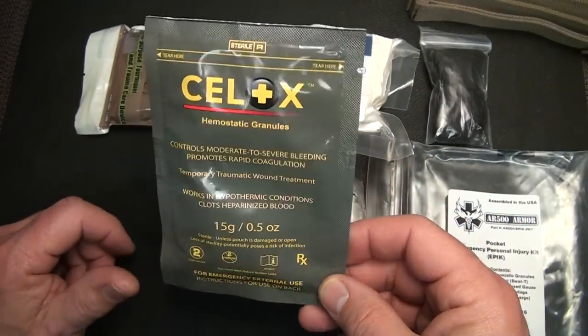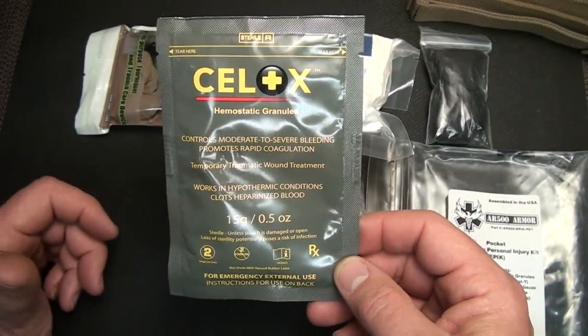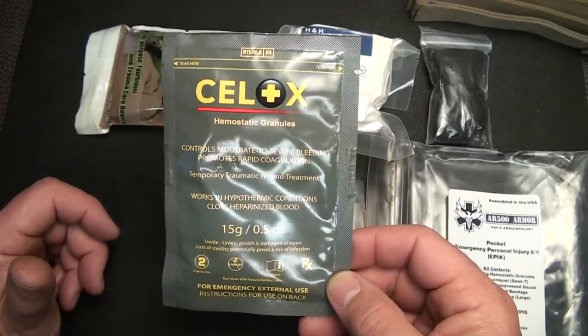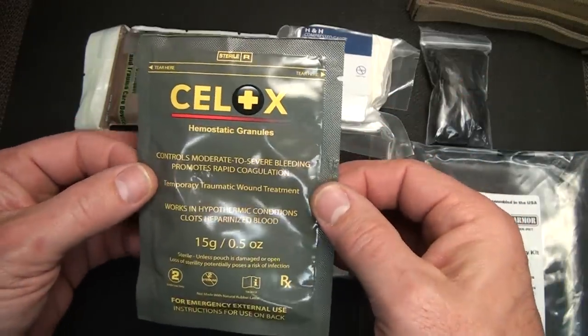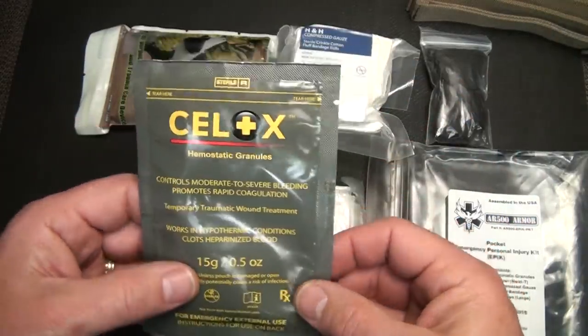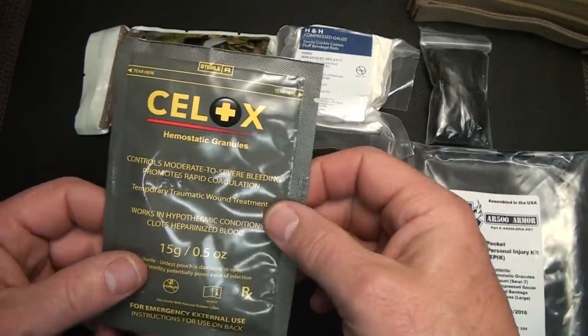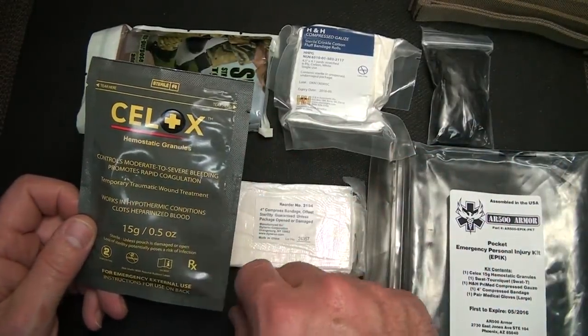I know at one time with QuikClot, especially the early version, they were causing second-degree burns at times. And so they did away with it for a little while, but they reformulated it. And Celox is an excellent company that makes this hemostatic agent. And so this is really great to have to be able to pour on the wound just to get that bleeding stopped, because that's one of the things that's really important, is to get it stopped.